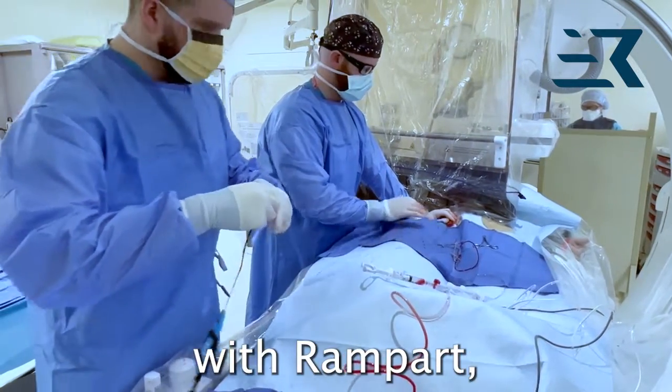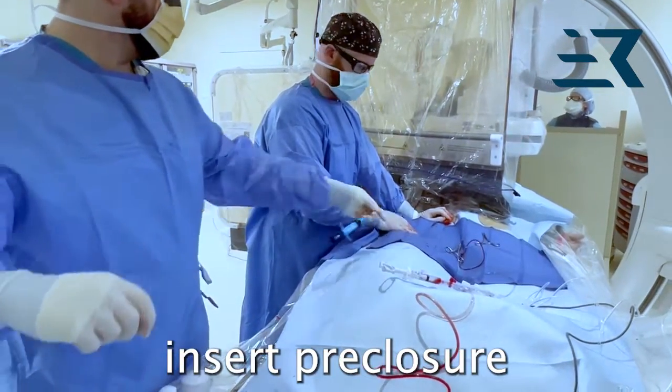For pre-closure with Rampart, after access, insert the pre-closure device.